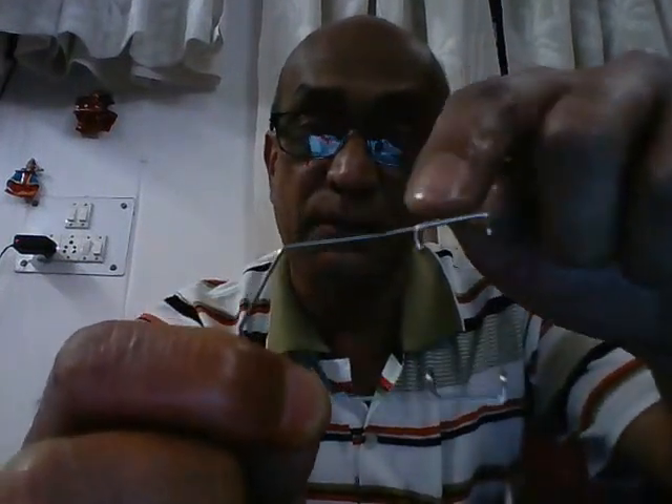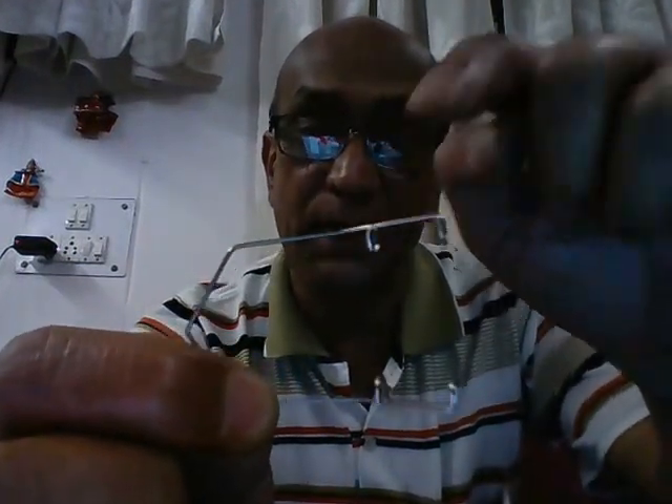Always remember that this angulated portion is the one which is on the temporal side, and this portion is the one which is inserted under the respective eyelids. So this limb goes under the upper eyelid, and this limb goes under the lower eyelid.